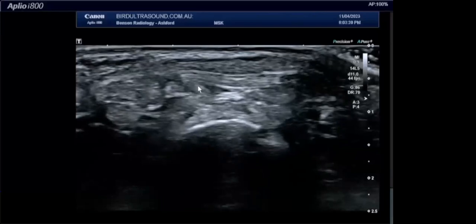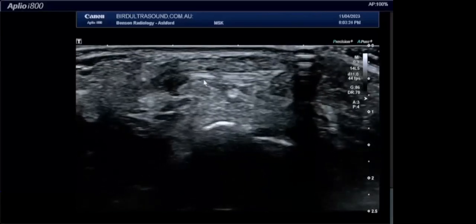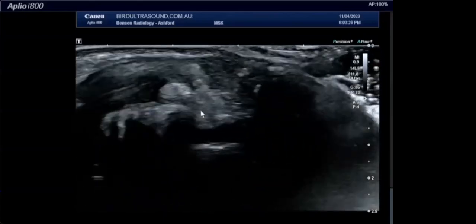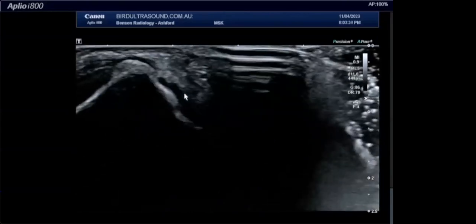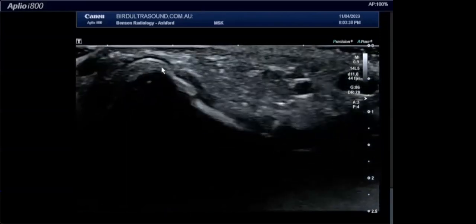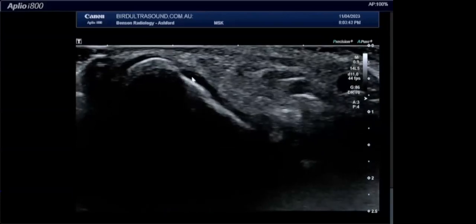And you can really account for the anisotropy. You can see it now going underneath my peroneal tendons here. So there's the CFL. There's my peroneal tendons going over the top and going right past them there. And again, watch how beautifully I can account for anisotropy here. And we're just going to arrive now at the fibula. And this is really a nice example of how you can actually see a little fossa on the fibula here, like a little facet that's made especially for it.